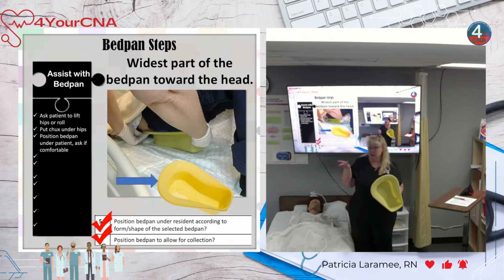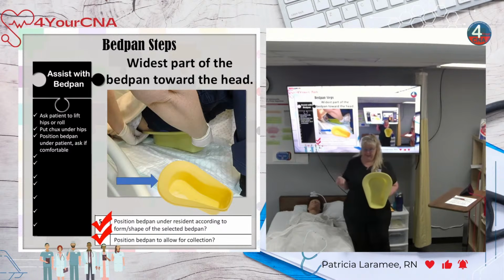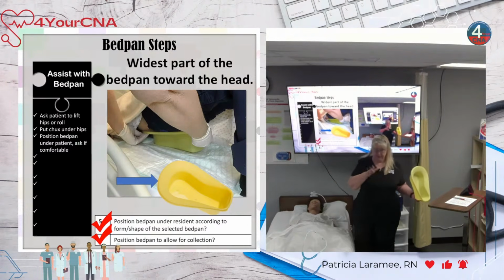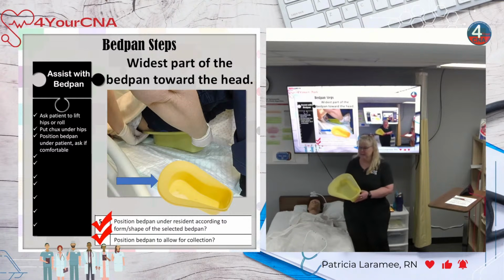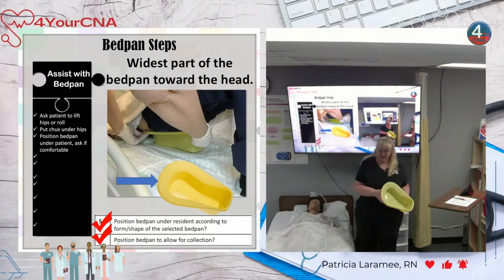So when they lift up to come off, the bedpan's going to lift too. And whatever's in the bedpan is now all over your bed and your patient. Not comfortable. So there is a way around this. Again, we're going to ask the nurse. Have to ask the nurse. But we can put cornstarch or non-talc powder on here, and that helps prevent the patient from sticking to it. It helps it slide under the patient super easy, but more importantly, after the patient's been sitting on it for a few minutes, it helps it slide right out without sticking.